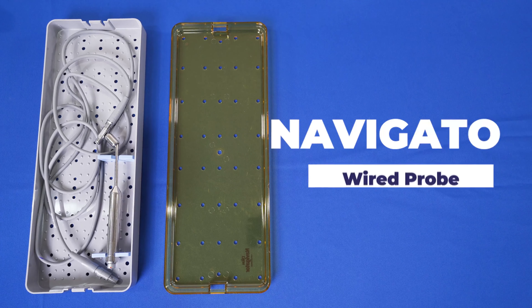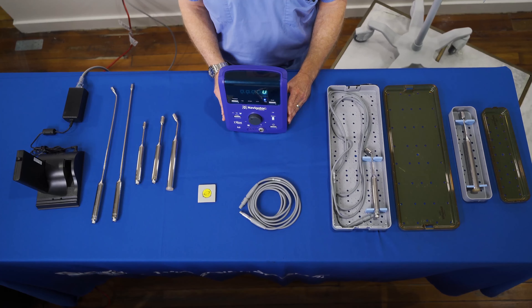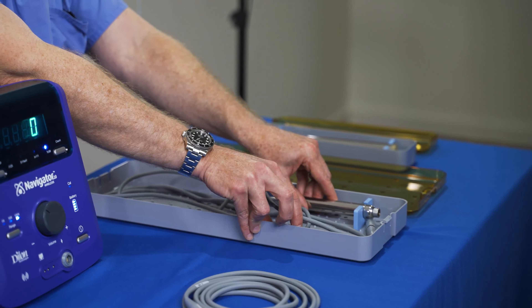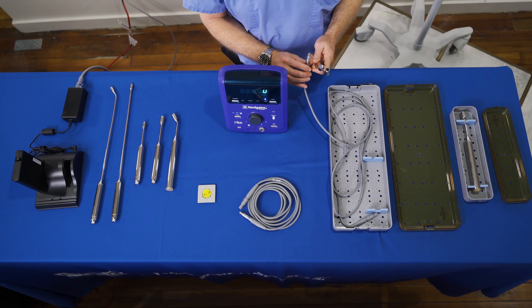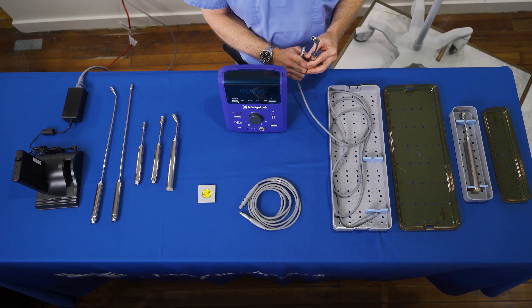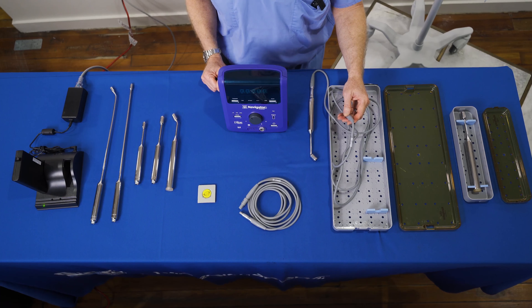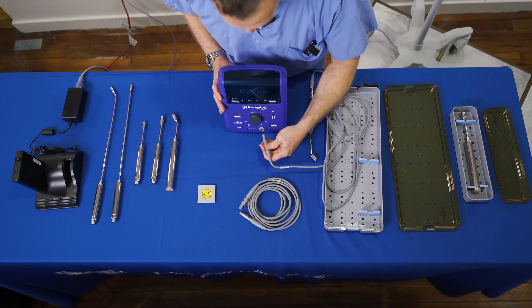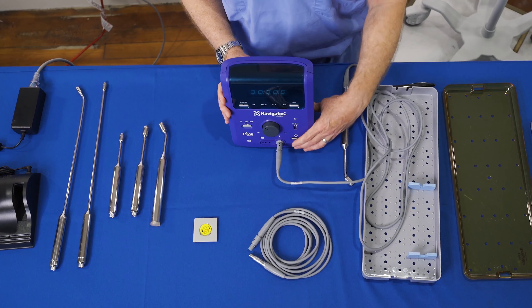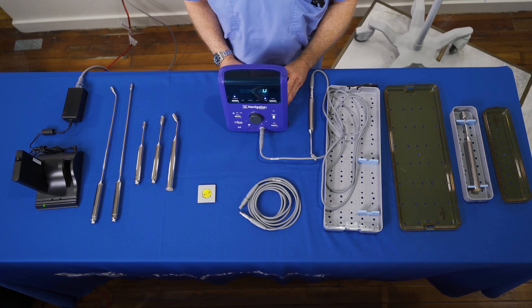In order to comply with standards of accrediting organizations such as the Joint Commission and the CDC, critical devices such as surgical gamma probes are sterilized at central processing. The wired probe will typically come to the operating room in a sterilization tray. Remove the sterile probe and cable into the sterile field. Prior to connecting the probe to the control unit, make sure the control unit is off. Connect the probe to the cable by making sure the red dots are aligned. Then connect the cable to the control unit by aligning both arrows. Press the Instant Power On button. When turned on, the display will read zero and the system is ready for use.